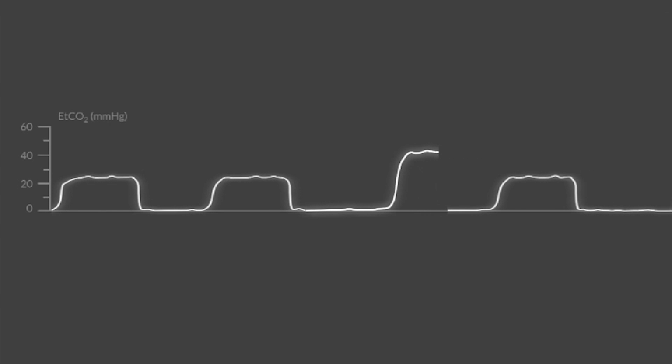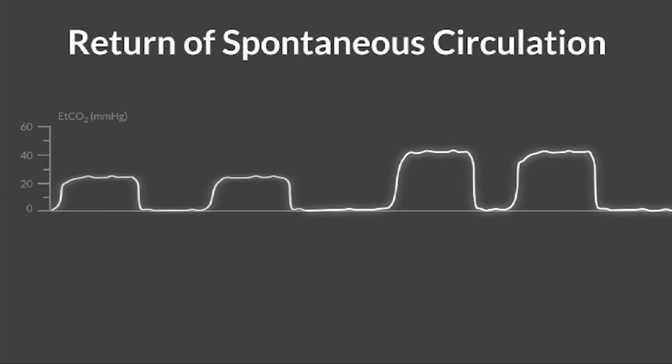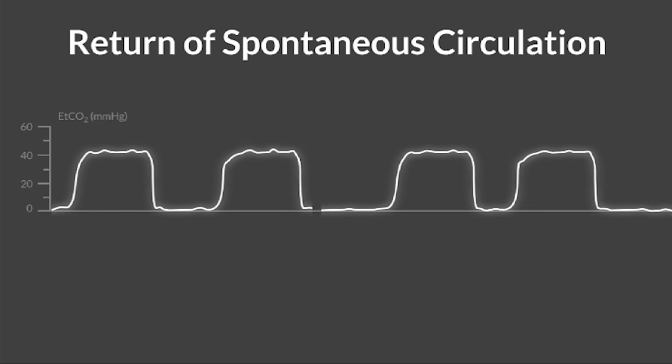Furthermore, a sharp rise of end-tidal CO2 to normal or higher levels is associated with return of spontaneous circulation. This increase is an early indicator of improvement in blood flow. That concludes our video on capnography.